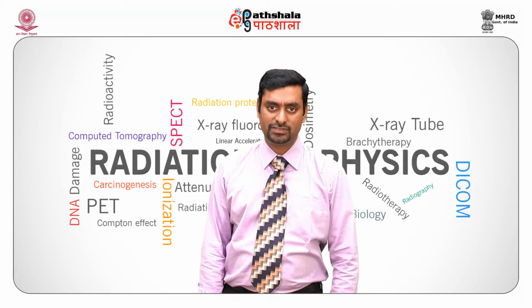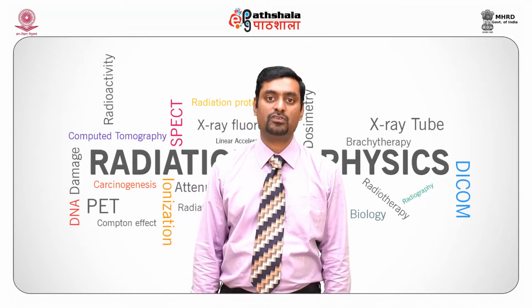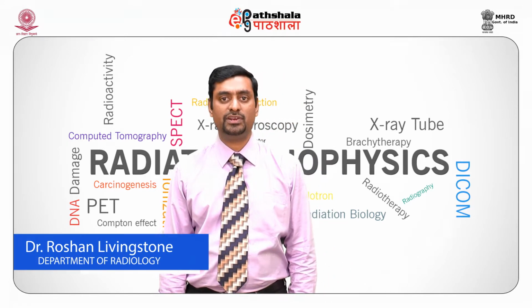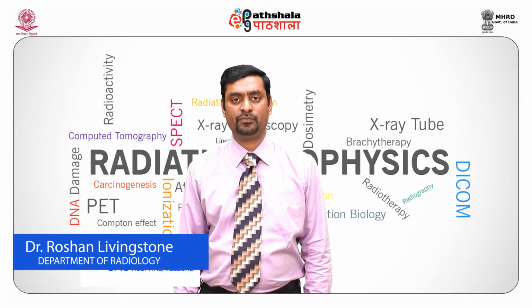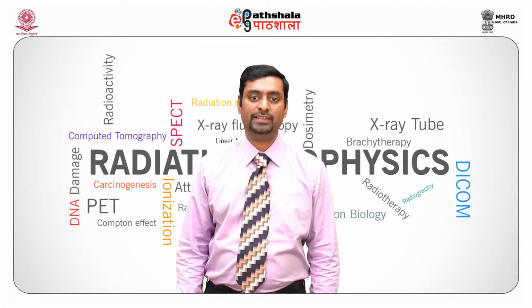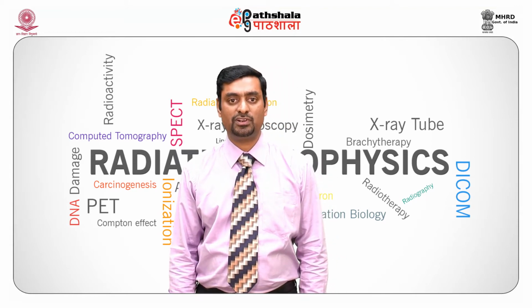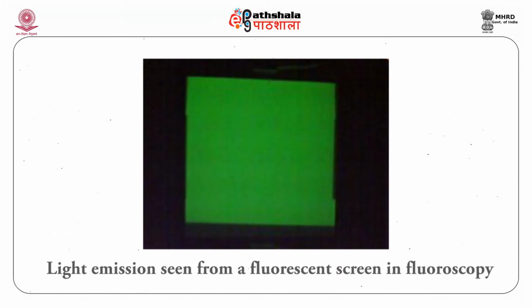Now, what is fluorescence? We were talking about the fluoroscopic imaging machine, so we need to know about fluorescence. Fluorescence is a phenomenon where certain materials emit visible light in response to some stimuli. The stimuli can be X-rays or electromagnetic rays, and the emitted light coming out from this material stops soon after the stimuli is stopped. In this small picture, you will be able to see light emission from a fluorescent screen in an early fluoroscopy machine.